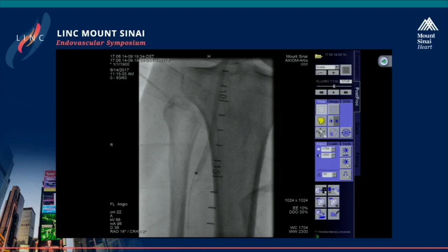In fact, one patient was very interesting. One of these 4 had bilateral SFA occlusions, used excisional atherectomy on both of those. He developed mirror image ectasia of the proximal SFA. It's very bizarre. Same operator? Pardon? Same operator? Yeah. And you're saying directional with drug-coated balloons? Because it sort of makes sense, right?